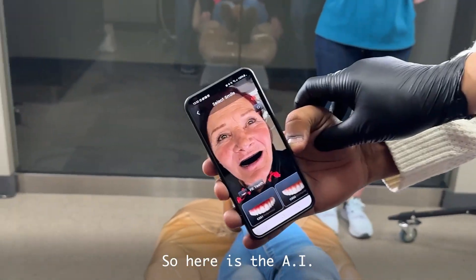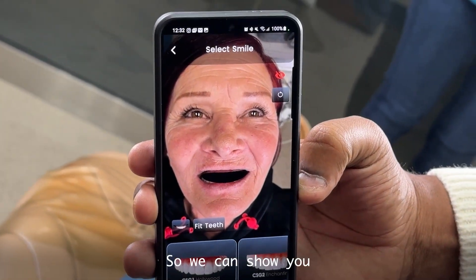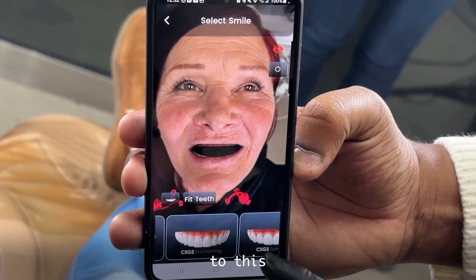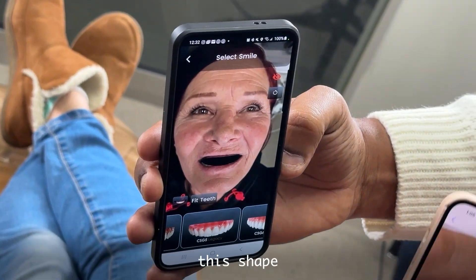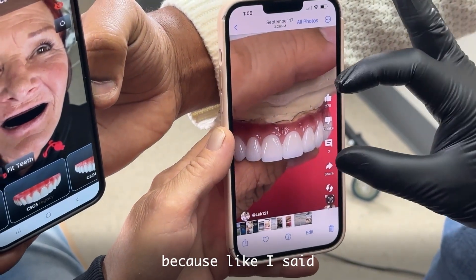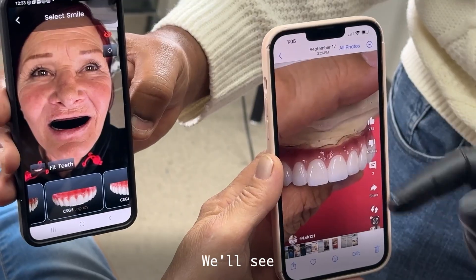So here's the AI. Now you don't have any teeth, so we can show you which tooth you like — from here to here. Patient: I like this shape, but with no pink. We'll try and make it without the pink. Because if I make the teeth too tall, then I need a pink. We'll see.